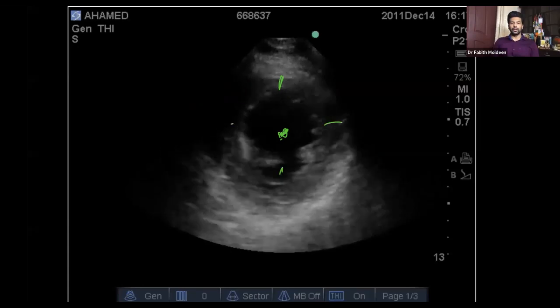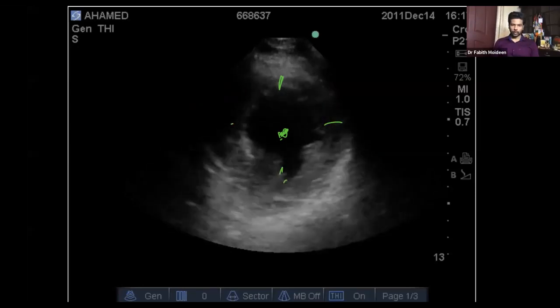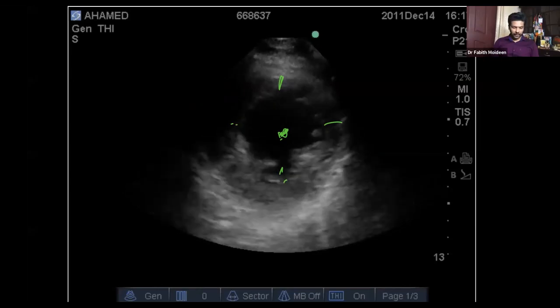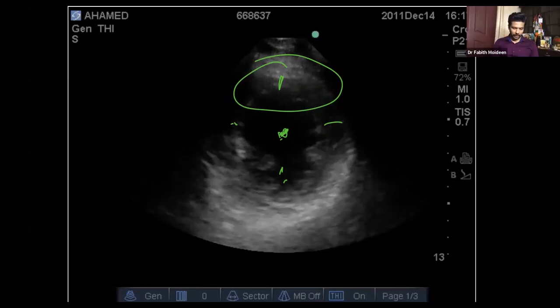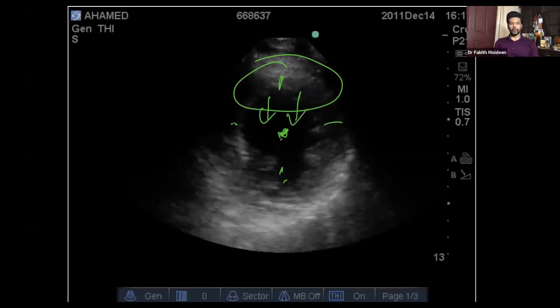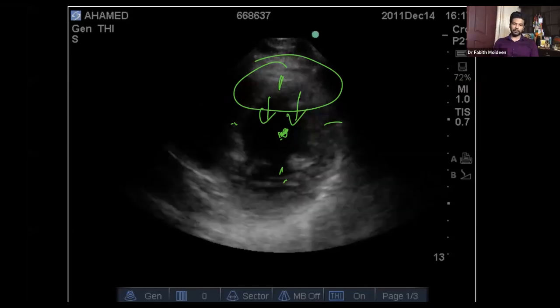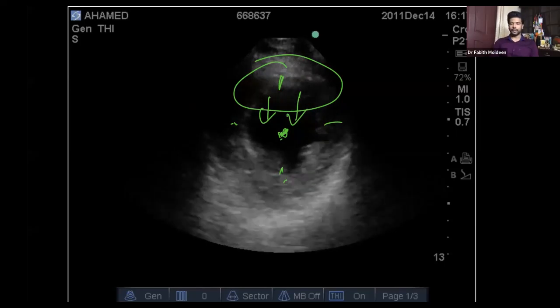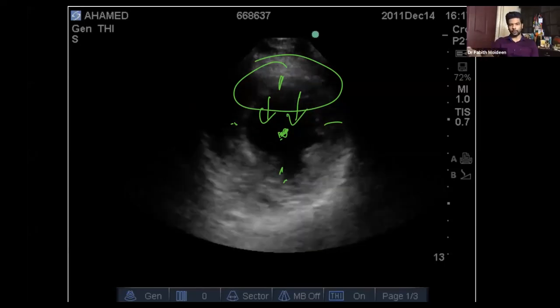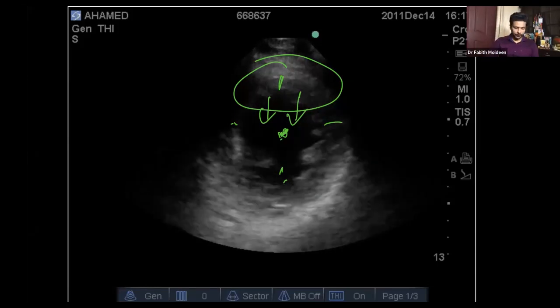You can see, comparing your inferior wall to the lateral wall and to the septum, the anterior part is not coming in and out. This part is not coming in and out, right? So there is a problem there. That's a hypokinesia of that place. Where a patient is coming with chest pain and with this kind of findings, think about a regional wall motion abnormality in the anterior wall. All right.